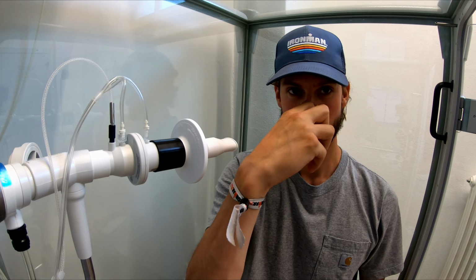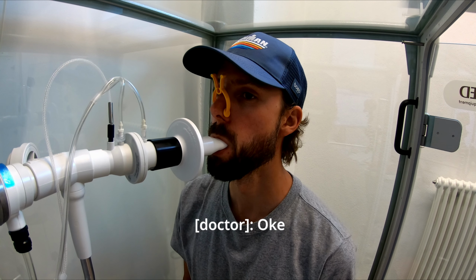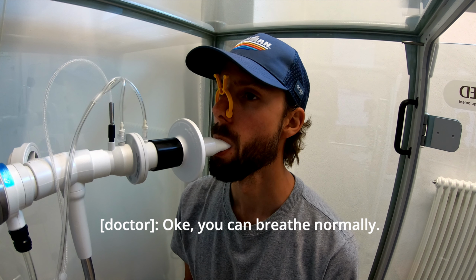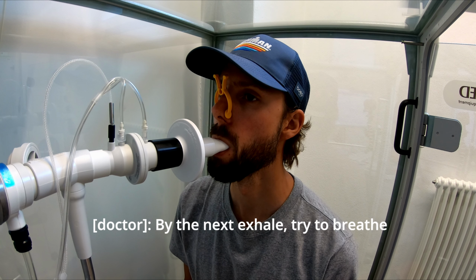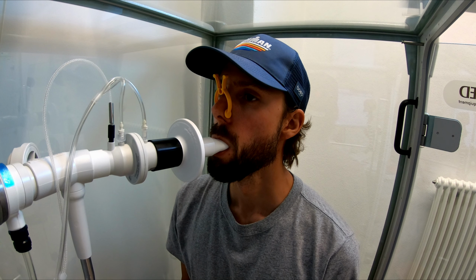So put this on my nose. Exactly. Okay, you can breathe normally. Next, exhale, try to breathe all out so that your lungs become empty. Breathe out.